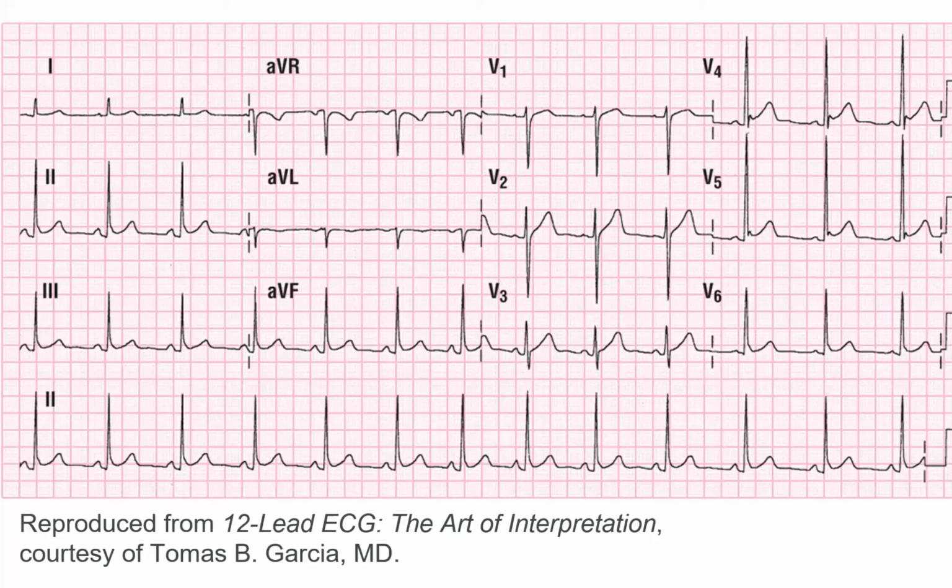Questionable. Questionable. Once again, we have that cupping. Do you guys understand what I mean by cupping? It does this U thing. What we're saying here is, yeah, that's a whole box up at the U. But why is it U-ing? We come down here to 3. We have cupping. It's U-ing. It's basically at baseline there at 3, but it's still got the U-ing. 2, or aVF also has a U-ing, and it's also basically at baseline. Okay, so we only have it in 2, similar to last time, but we have cupping in all 3 of these this time.